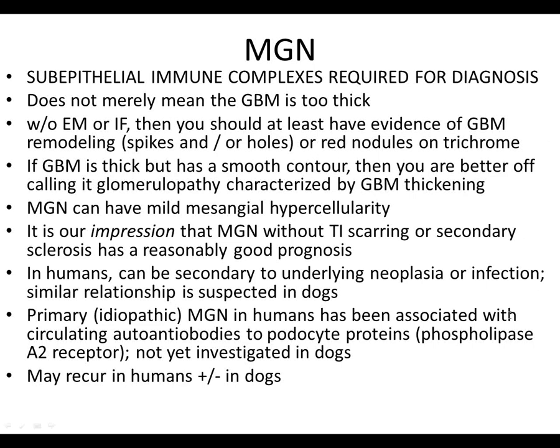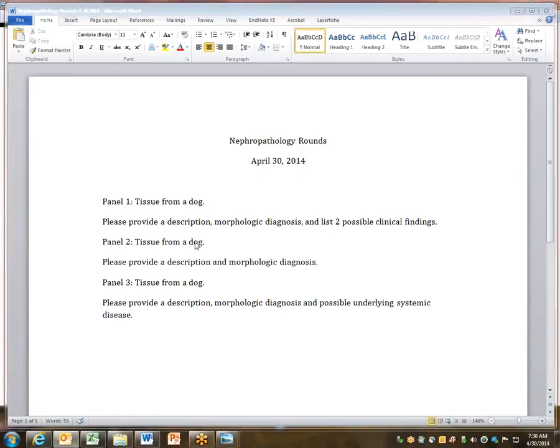Okay, so we can go to the next case, George, which is a little difficult. It's maybe not something that everybody has seen because it wasn't in the original paper I sent.